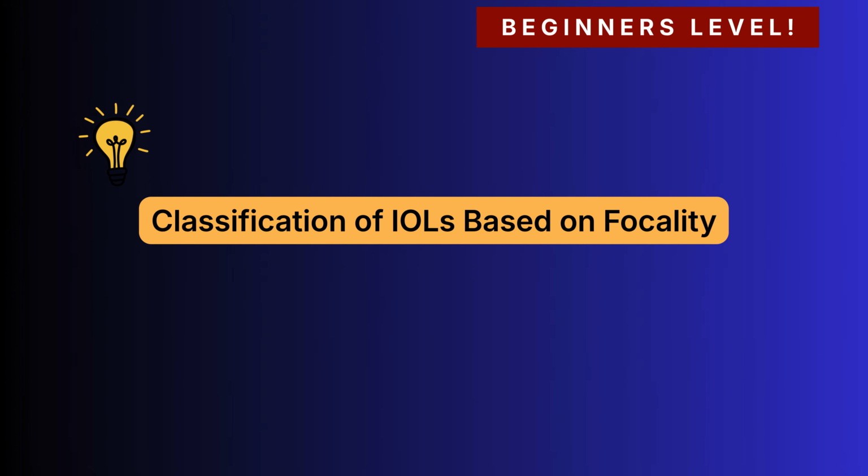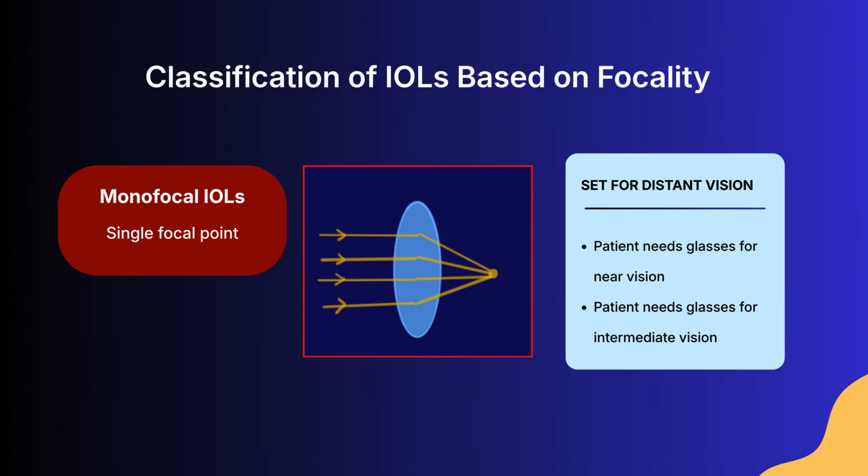Based on the way they create focal points, intraocular lenses can broadly be classified into three main types. Monofocal IOLs, these lenses create one single focal point, and usually this focus is set for distance vision, which means patients often require glasses for near vision or reading.